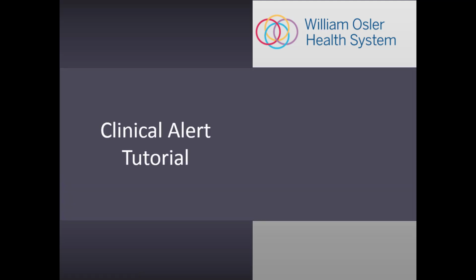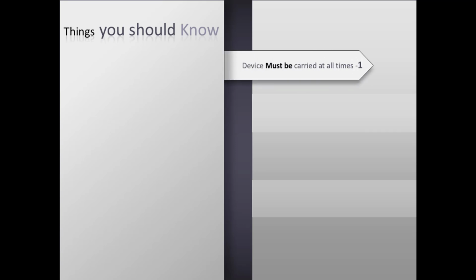This video has been prepared for the unit leaders who manage clinical alerts at the William Osler Health System. Before we start the tutorial, there are a few important points to mention about your responsibility as a charge nurse managing clinical notifications. Number 1, the device must be carried at all times.